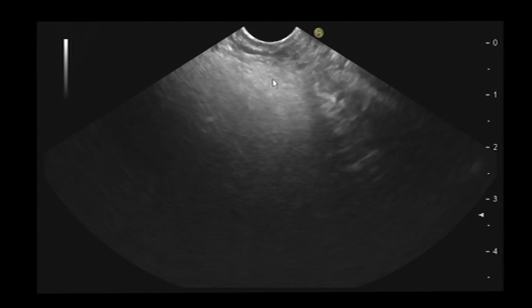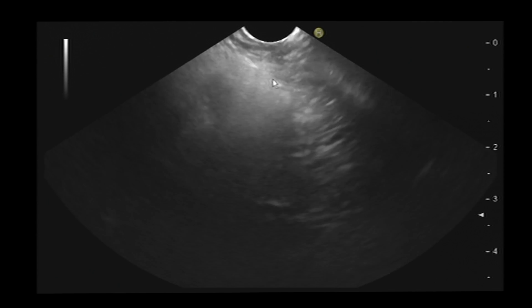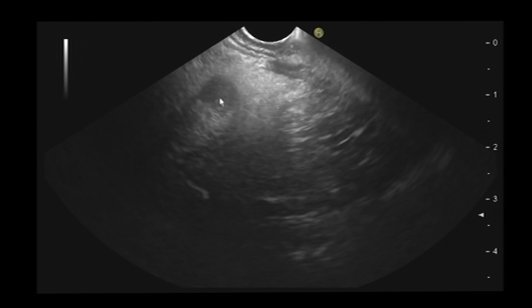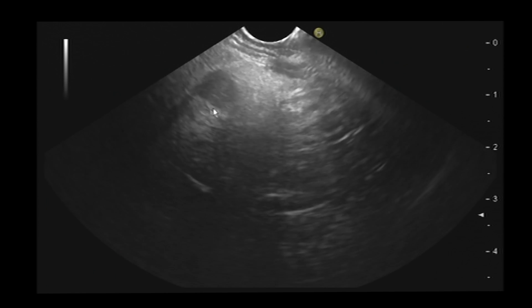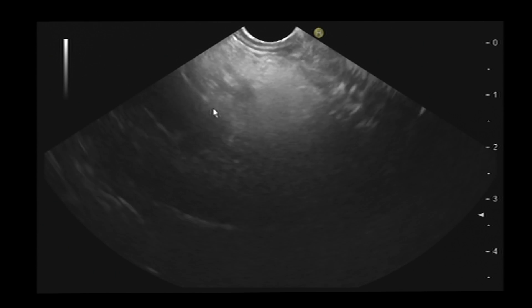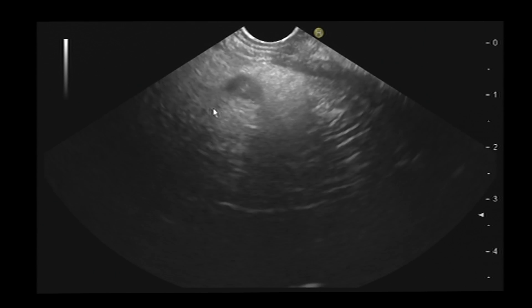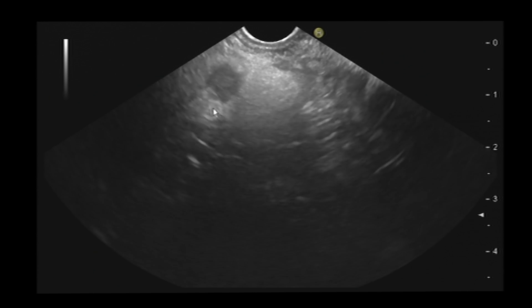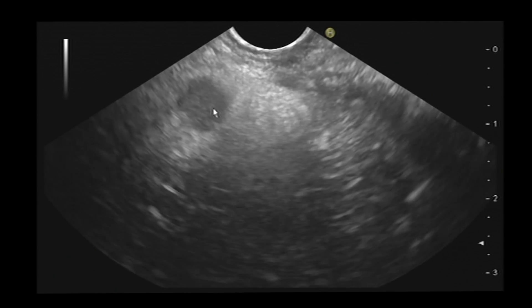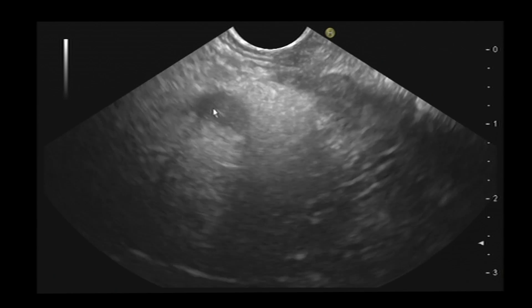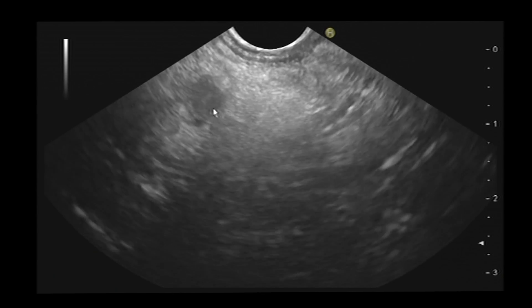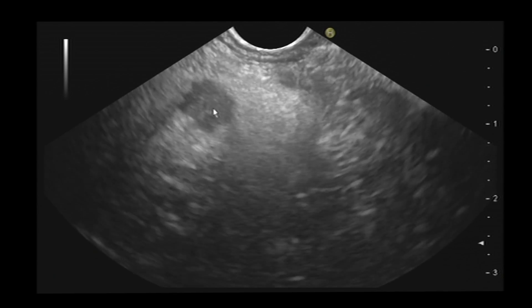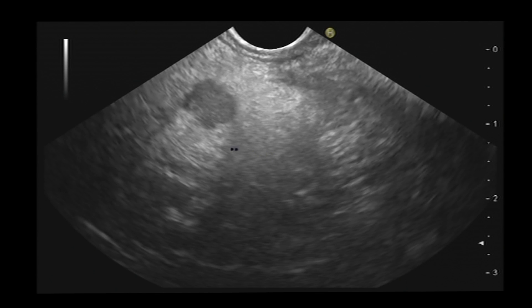I will try to find the lesion. Here we have the lesion — this is the lesion. I will try to put the lesion in the middle of the image to have a better view. I increase the size of the image. This is a small, a very small lesion. You see the size of the lesion is eight millimeters.